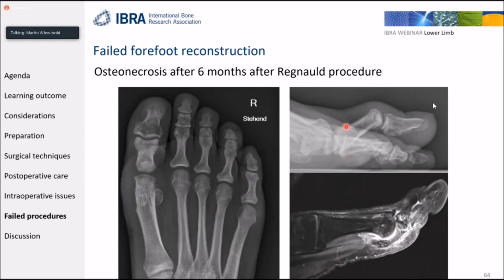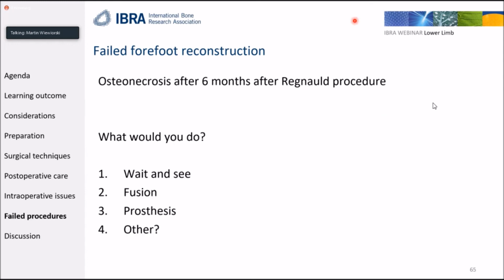It's just mush. And this is an MRI here. It's subluxated. I think there's some surface going on, but the bone is definitely not healthy. Probably some necrosis of the sesamoid is also going on here. It's hard to tell. There's a joint effusion. So what do you want to do with this patient? She's 26. I don't see any way to fix this, to reconstruct this.